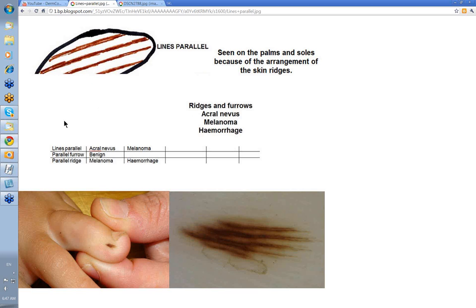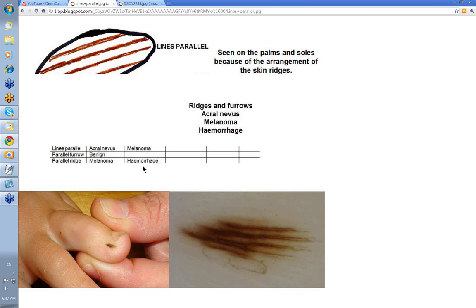The two patterns we have to look at are the parallel furrow pattern — the common one with pigment in the furrows — and the parallel ridge pattern, where instead all the pigment is in the thick ridges and the furrows are clear. Parallel ridge pattern indicates melanoma or hemorrhage, while parallel furrow pattern indicates a benign nevus.